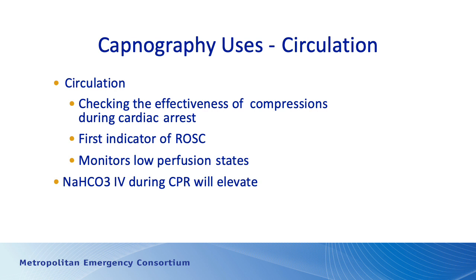If we give the patient in cardiac arrest a dose of IV sodium bicarb and CPR is continued, you may see a transient increase in the CO2 level, even though there's no ROSC. And that's simply because sodium bicarbonate is metabolized when mixed with acid into carbon dioxide, so it will increase the amount of carbon dioxide in the blood. And even if you have a low flow state, this may be enough of a change to result in a change in the capnography values as you're doing compressions.